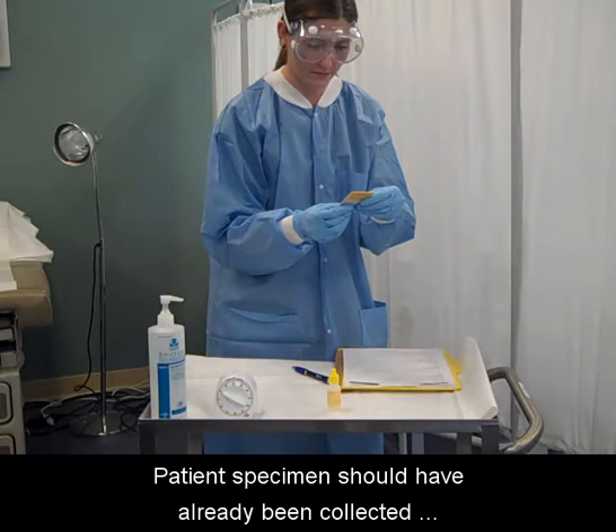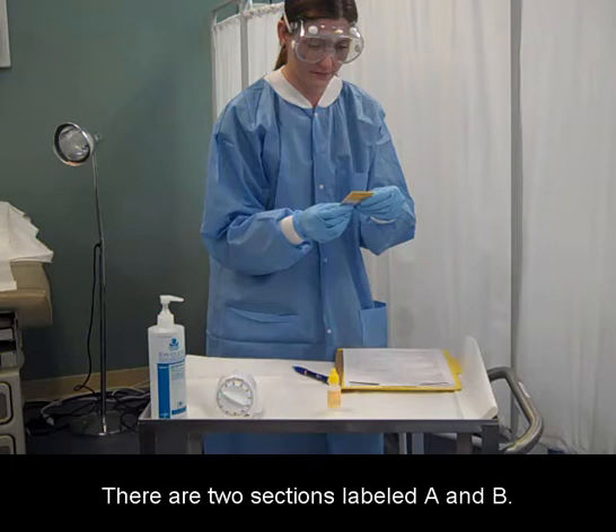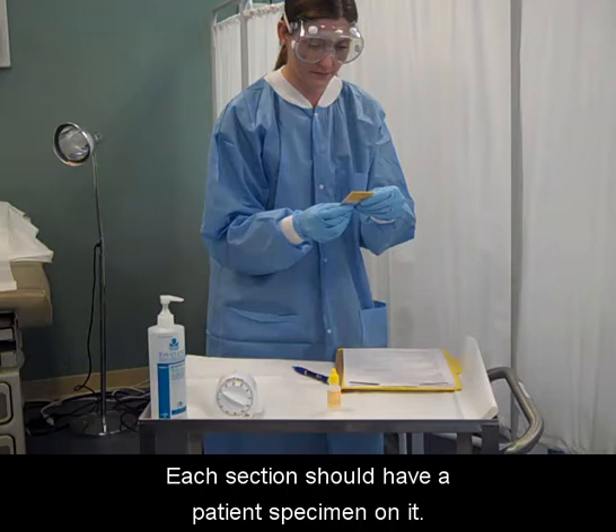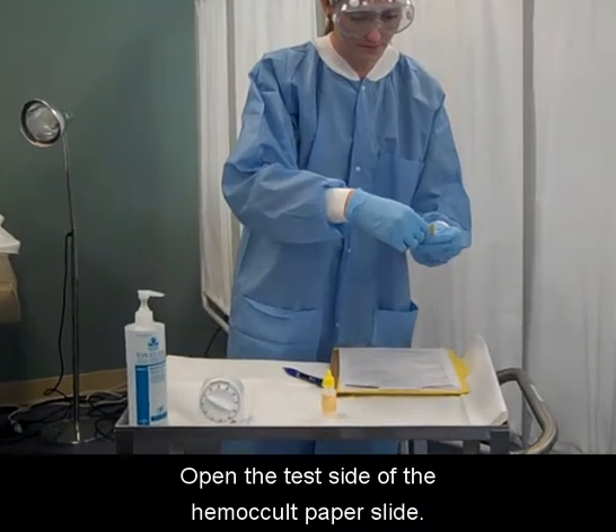The patient specimen should have already been collected and placed on the Hemocult paper slide. There are two sections labeled A and B. Each section should have a patient specimen on it. Open the test side of the Hemocult paper slide.